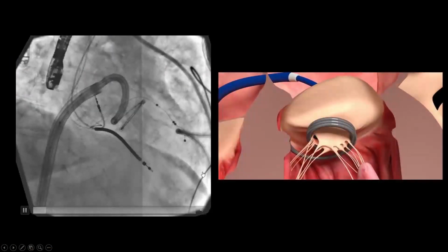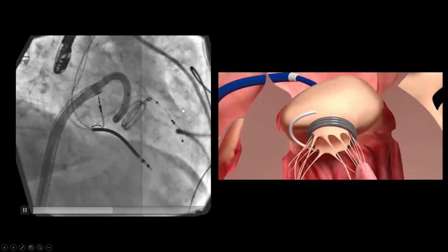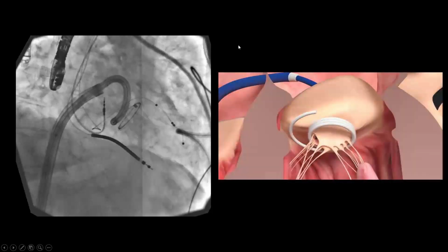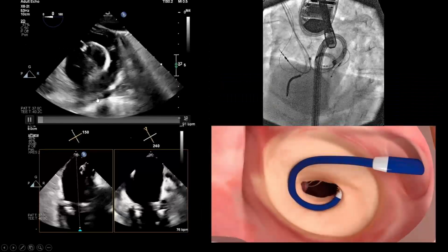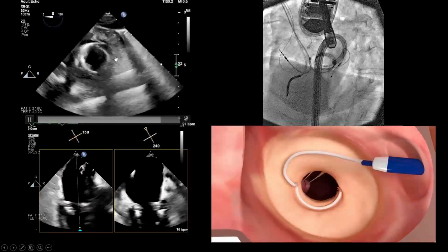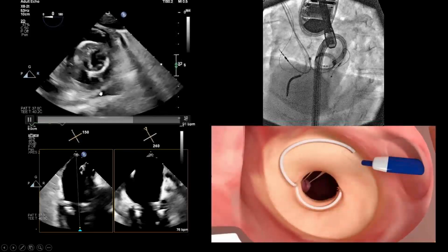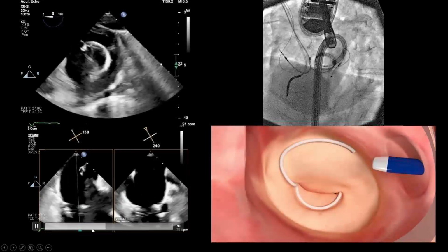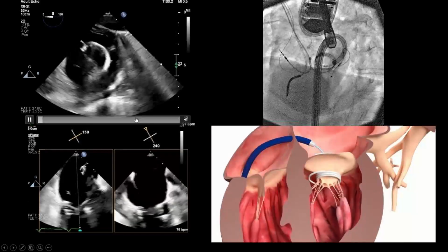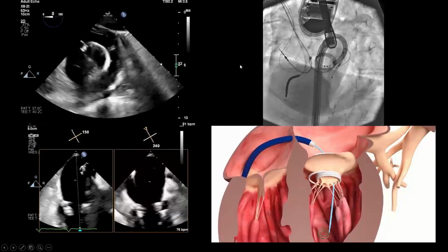After that, a few seconds after, once you have the leading turn done and you've cleared the LVOT, a few seconds later, you would have the second and third turn. Typically, they go smoothly as long as you have had a successful first turn. This is a transgastric view, short axis below the valve, and you can see this is the docking system now with all 3 turns complete, and you can see the entire subvalvular apparatus is within the docking system. And over here with the X-plane, you can see posterior, anterior, lateral, medial all have 3 dots under them, again indicating a successful deployment of the docking system under the valve.